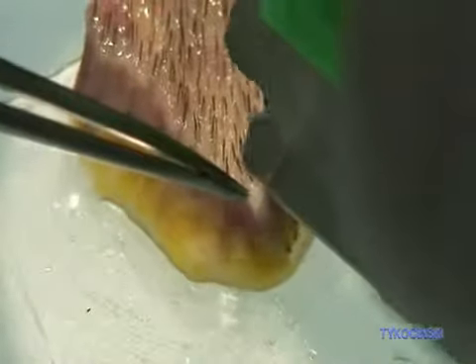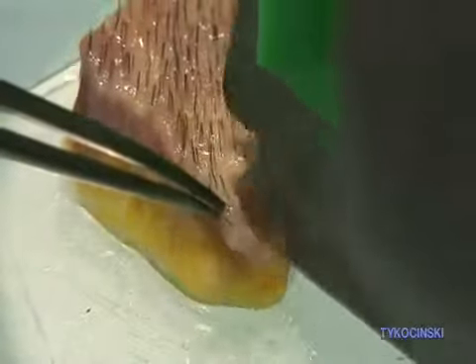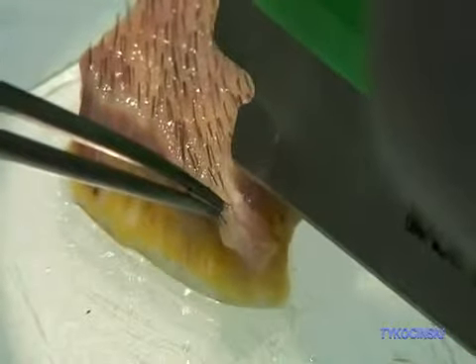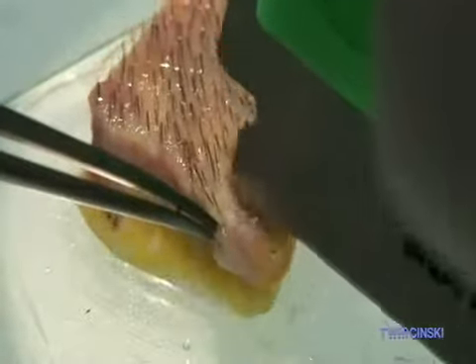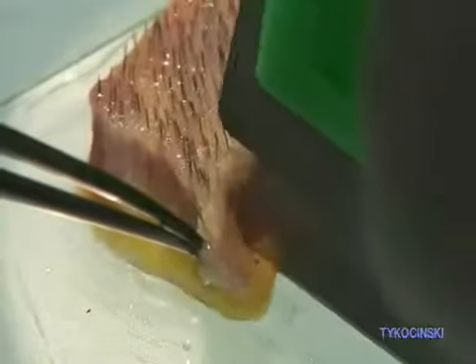That way, we can have dense packing — a lot of 3s and 4s, and sometimes 4-hair follicular units — and we can place them in small incisions to increase hair density. Because we don't need just graft density, but we need hair density. That's the best way to increase hair density.